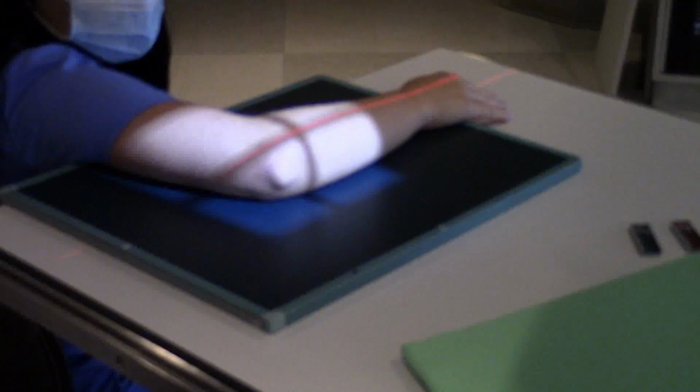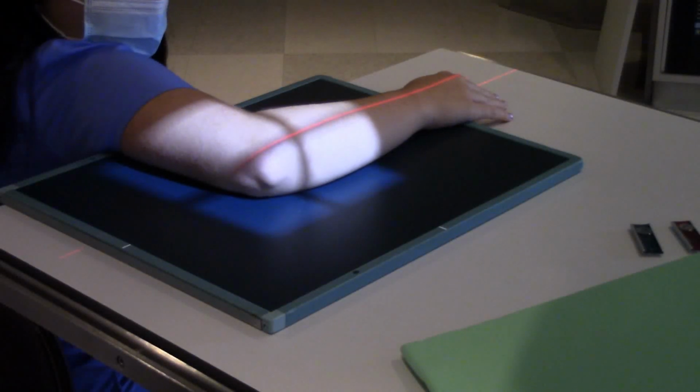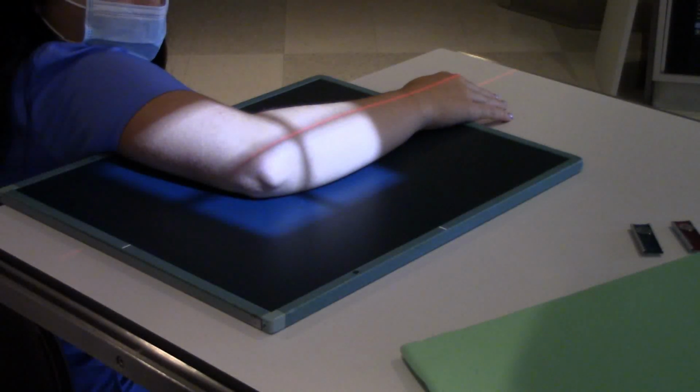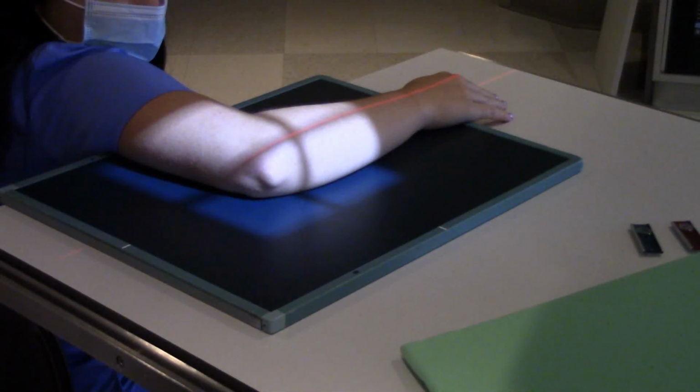Okay, now is that patient's elbow at a 90-degree angle, or is she slacking on us? There you go, that's better. See how that central ray is going to be right in front of her humerus?